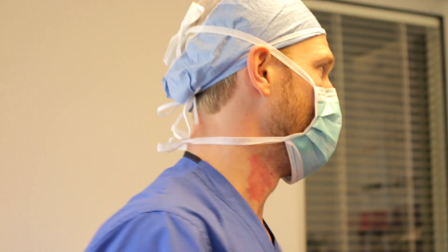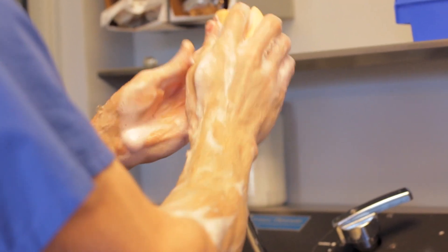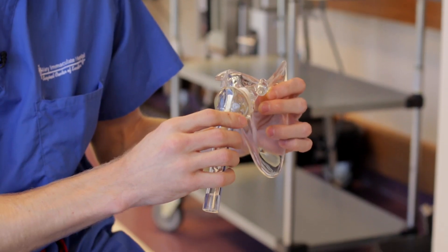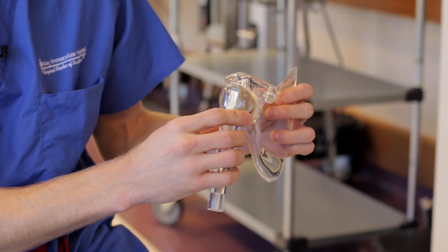A reverse shoulder replacement is when we replace the shoulder, but we actually replace the socket with a ball and the ball with the socket. When there's a rotator cuff tear, the shoulder slides out of place, and that causes more bone loss and more pain as the humerus bumps into the acromion.